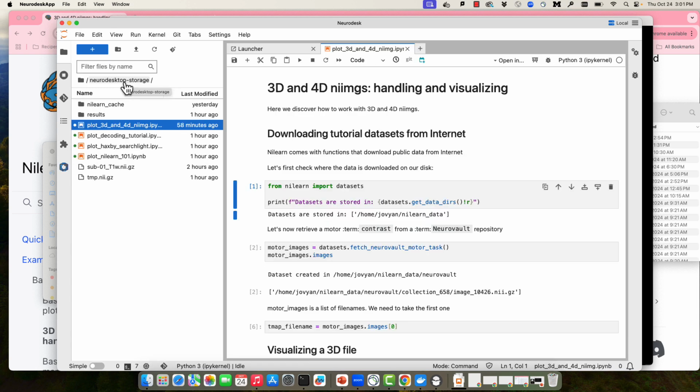So at this point, we have a Jupyter Notebook open. And again, we're not going to get too much into Python commands. Most of the edits we're going to make are going to be very minor. But to work with these Jupyter Notebooks, know that these things are called cells. Anything with a number next to it, like 1, 2, and so on, those are cells of code that can be executed. You can run them. You should get some kind of output from them. Everything else is commentary. That's the markdown language, just for readability and visualization.